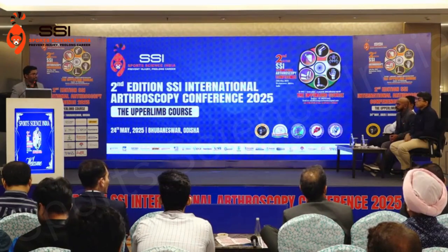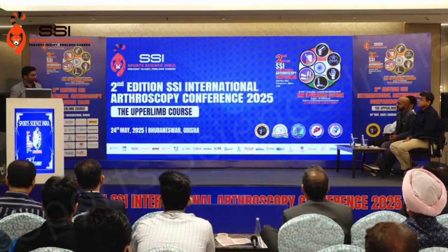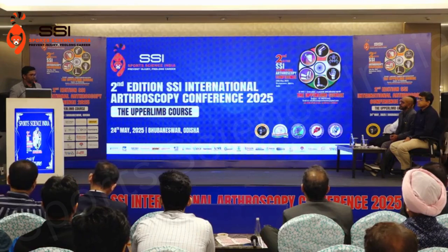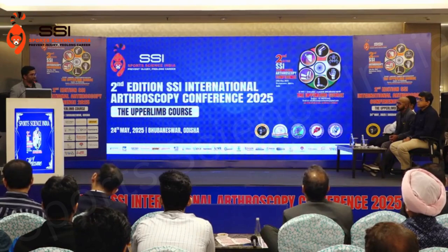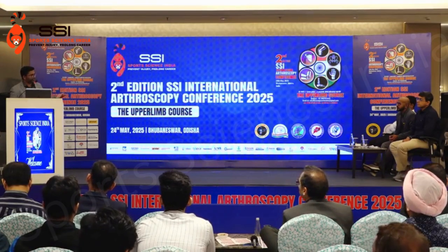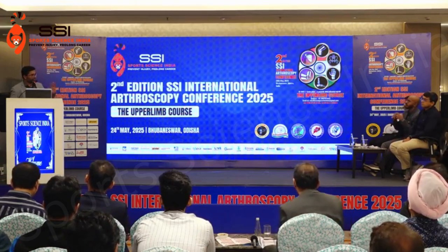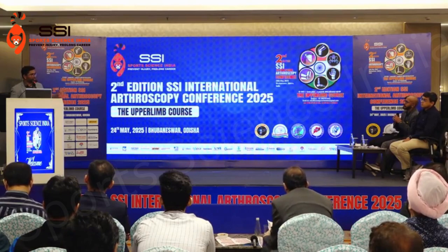To be honest, my subpectoral tenodesis is only for a biceps rupture. I've done only 2 or 3 such cases; I prepared that just for the sake of the talk. In my clinical practice nowadays, I'm doing the zone 2 fixation, because if I have a rotator cuff repair concomitantly, I am able to use the remaining biceps for augmentation. If I have to do an isolated biceps tenodesis, I'll just do a zone 1.